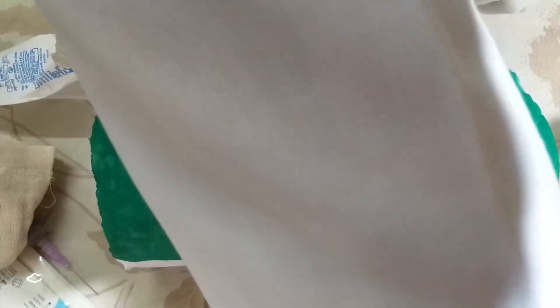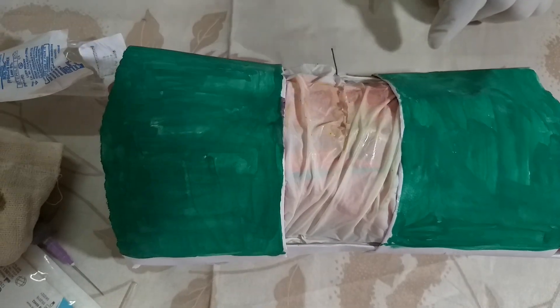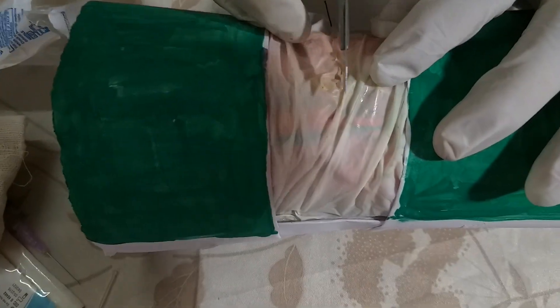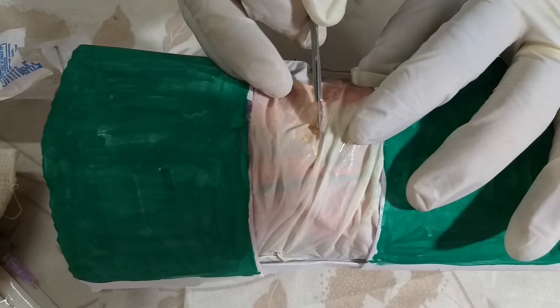Once the area is anesthetized, you just check it by piercing the skin and asking the patient whether he is having pain or not. If the patient is not having pain, the area is totally anesthetized. Once anesthetized, you take a blade and give a horizontal incision of about two centimeters.